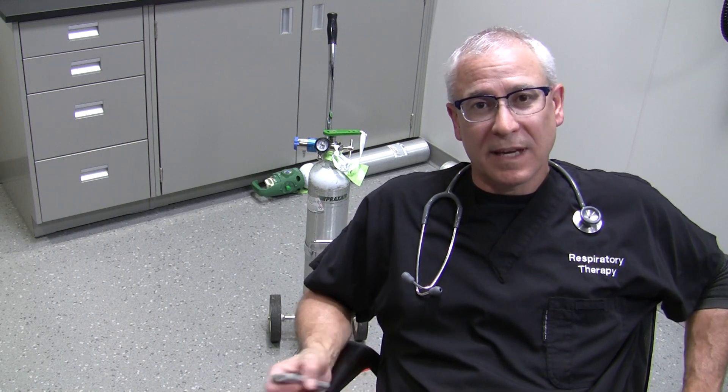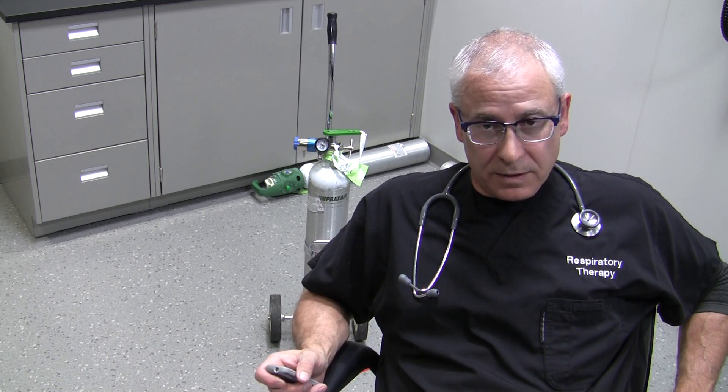Hi, this is George, Registered Respiratory Therapist. What I'd like to show you today is the differences between a standard oxygen cylinder — a compressed gas cylinder to be more specific — that you have to attach a regulator to, and the grab-and-go variety of cylinders that exist out there.